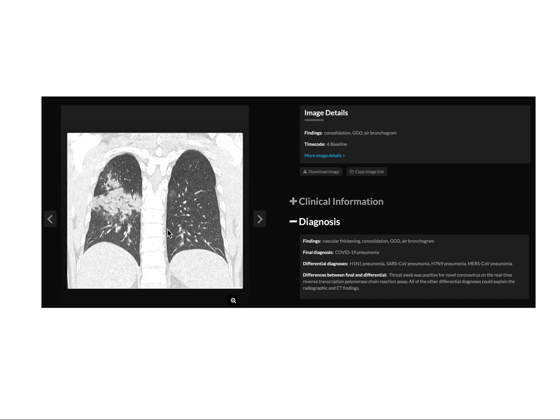Another case has evolved into consolidation with surrounding adjacent ground-glassing, which is a proven case of coronavirus.